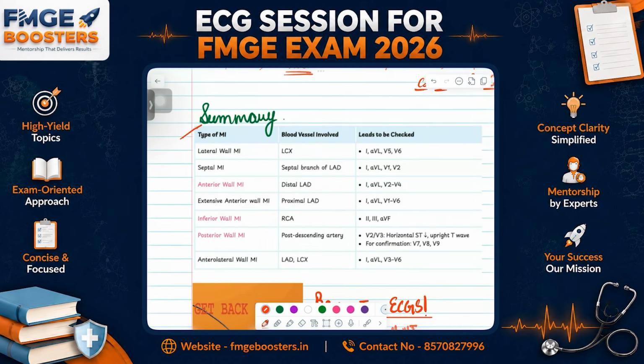And this is the summary which I have already told you. You guys have to remember it. This is very important for diagnosis. For myocardial infarction, this is important, and for general, all three things are important: regular, irregular, sinus, non-sinus, and the heart rate. Okay, let's go.